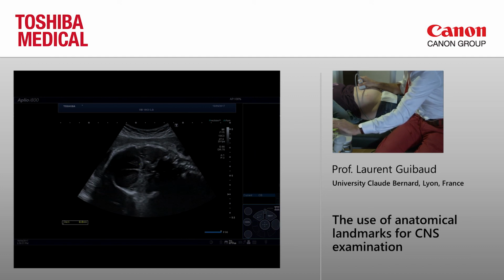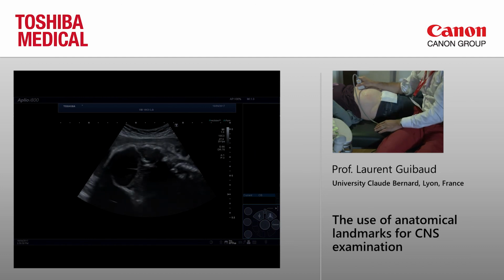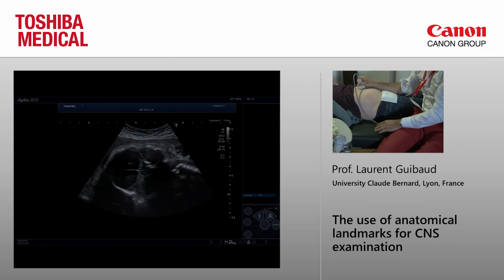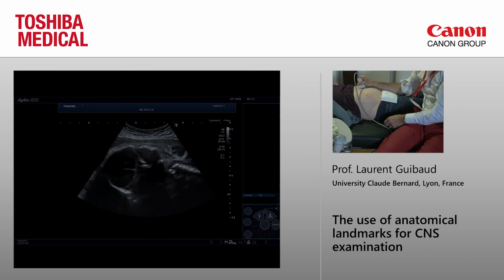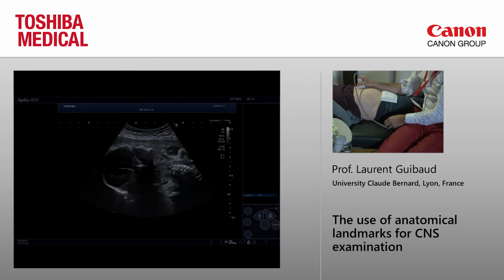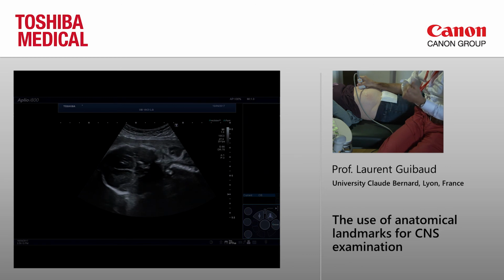Maybe it will be here, but I don't really trust ultrasound because in CHARGE syndrome, you know that in most of the cases, you have abnormalities of the olfactory structure. It can involve the sulci, but the sulci can be normal with absence of the bulb, and it can be unilateral or bilateral.